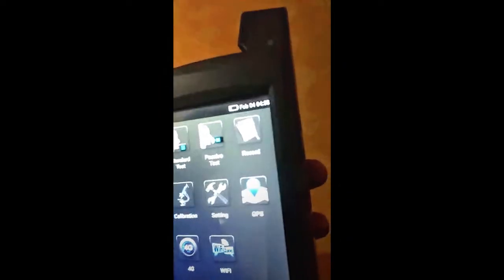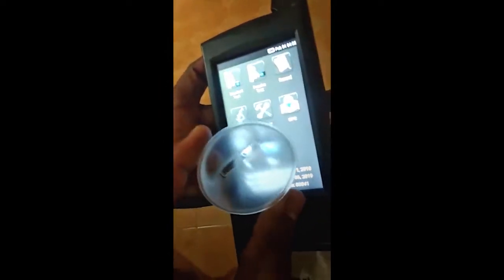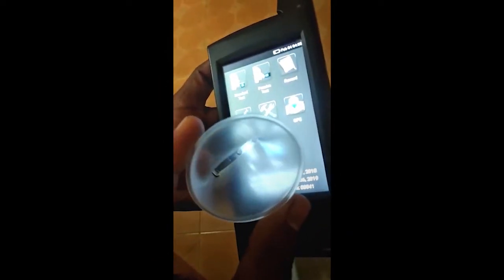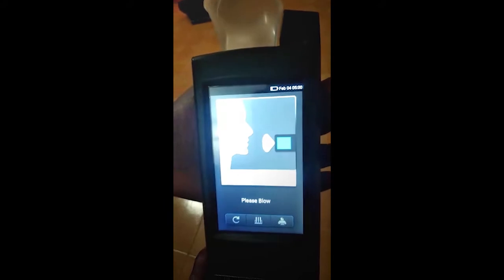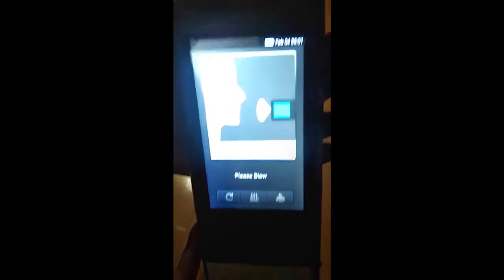This is the strip. This is the kind of strip they have to use. We have to insert the holder here and click this. This is the passive test window and we have to blow from here.